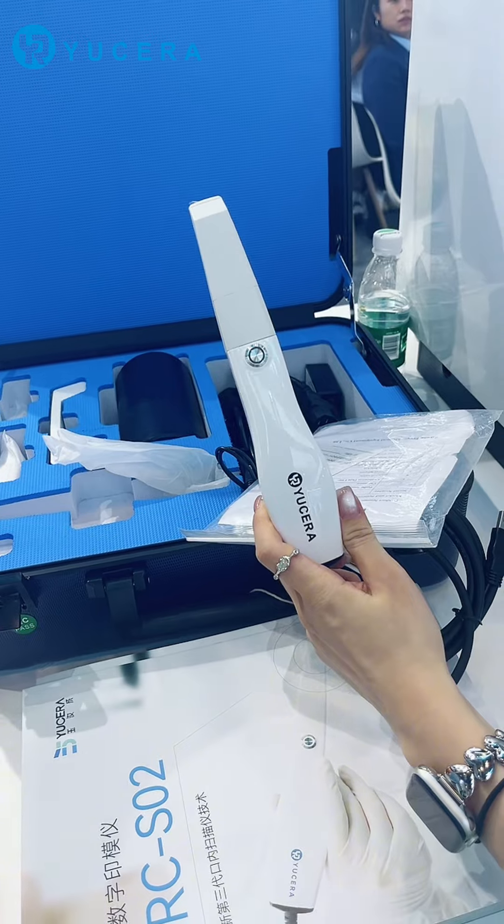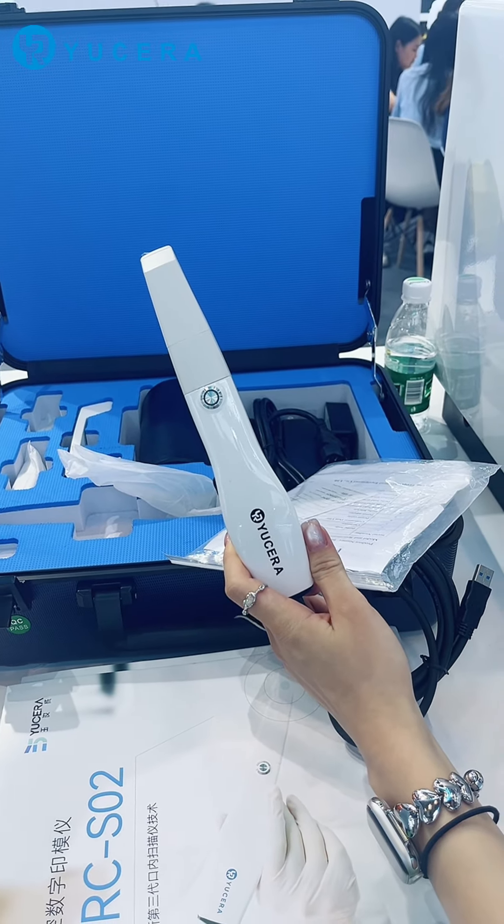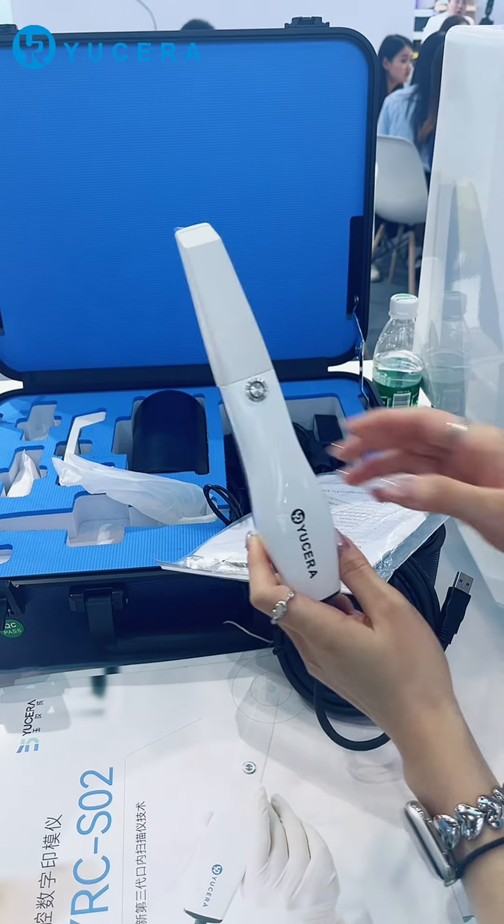Third, there is no need to spray powder. The colors are realistic, and the details of the teeth in the mouth are truly restored. And about the selling points.